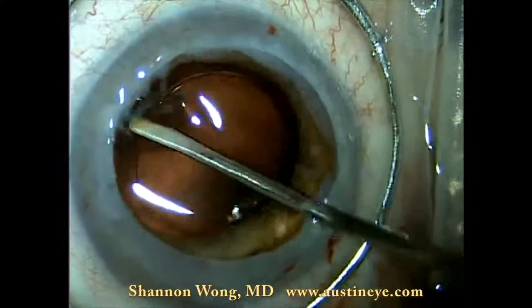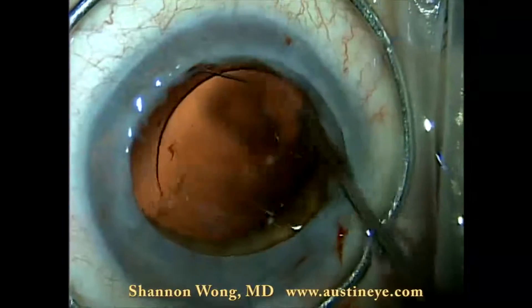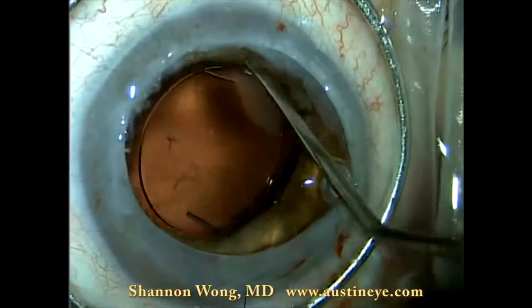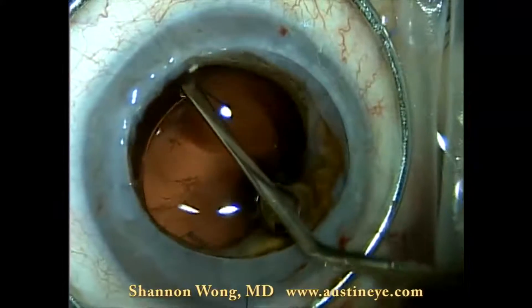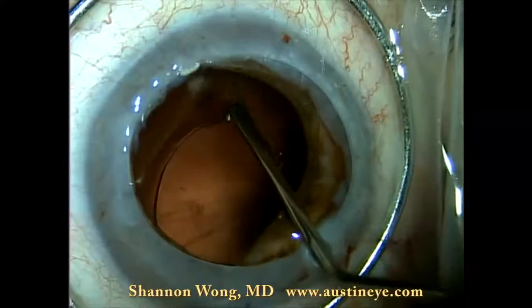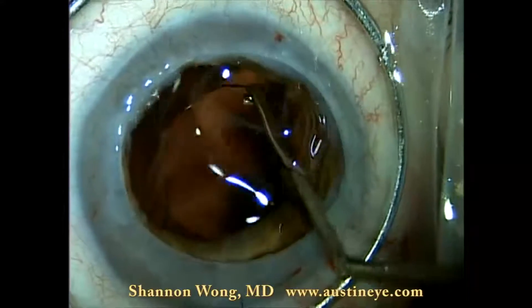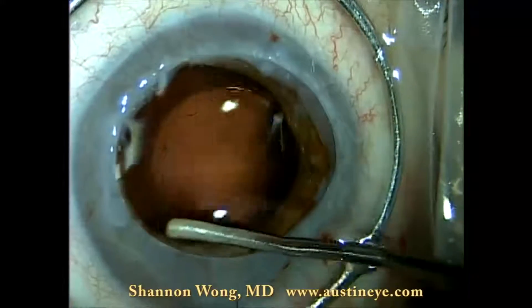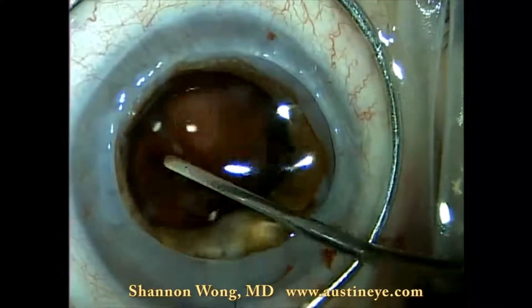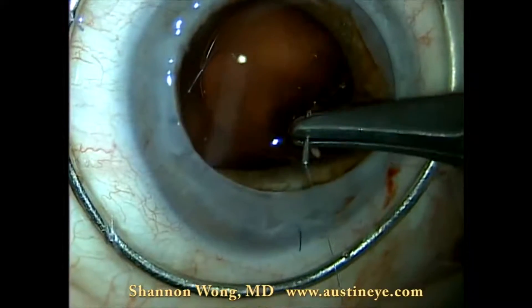The lens ends up centering while in the ciliary sulcus, and our next step is to do a pupilloplasty using Prolene. This is the patient's third trip to the operating room — the first being the primary corneal transplant for keratoconus, the second being the cataract surgery. We wanted to make every effort to avoid bringing this patient back to the operating room again.